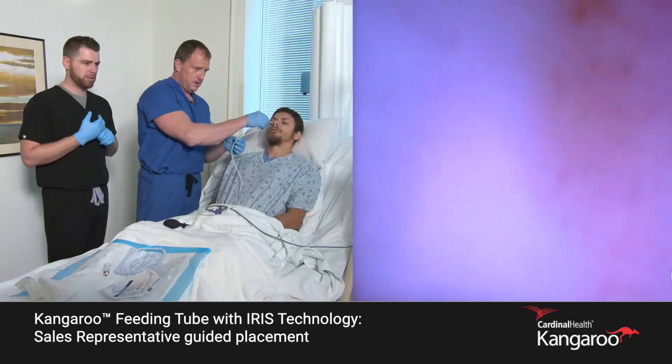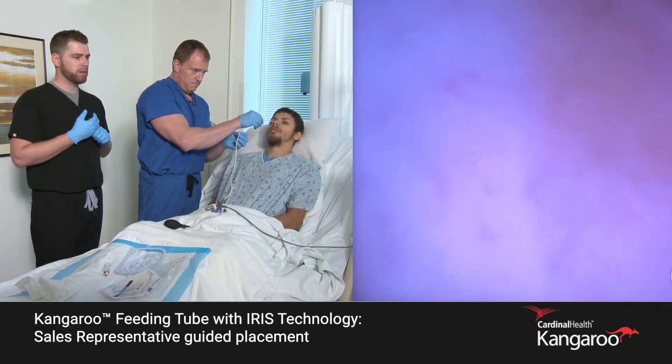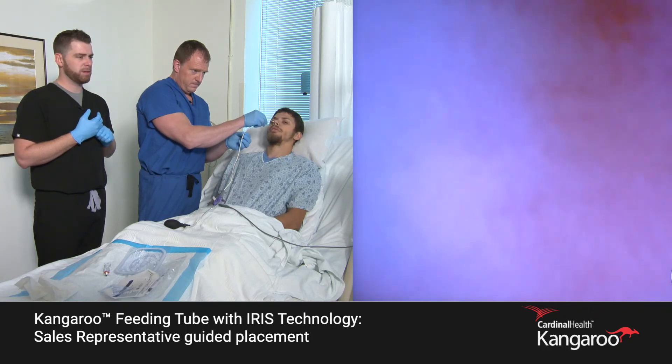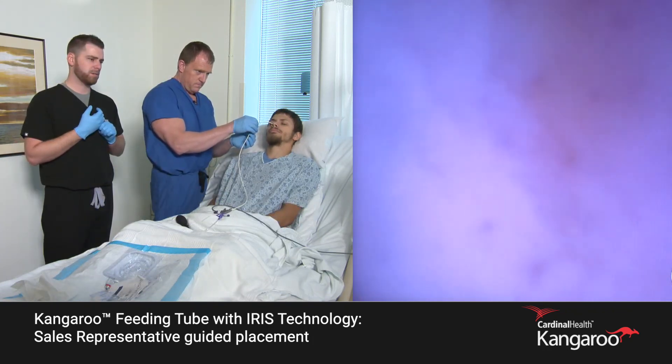Let's slowly advance. Once we pass through that pylorus, it's going to be a rapid movement — you'll see the tube drop quickly, and that's what we're looking for. Keep the resistance behind it and keep the feeding tube moving forward. We're watching the camera advance across the stomach wall.